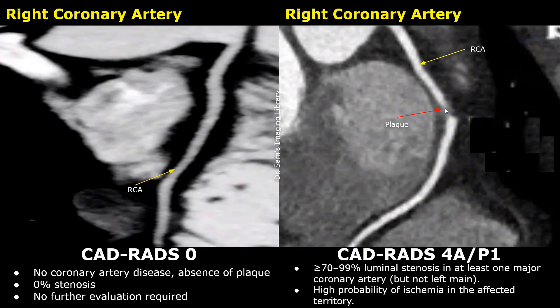CADRADS-4 indicates severe stenosis. It has two types: CADRADS-4A and 4B. In 4A, the stenosis is between 70 and 99% in at least one major coronary artery, such as the left anterior descending artery, left circumflex artery, or the right coronary artery, but not the left main coronary artery.